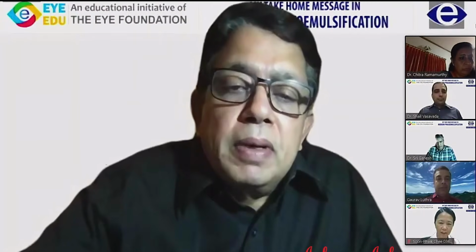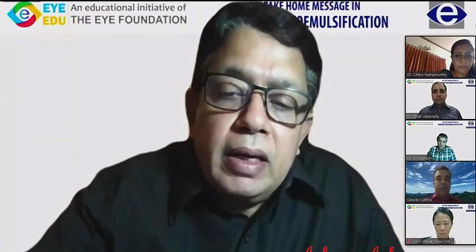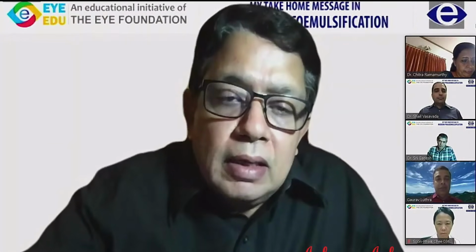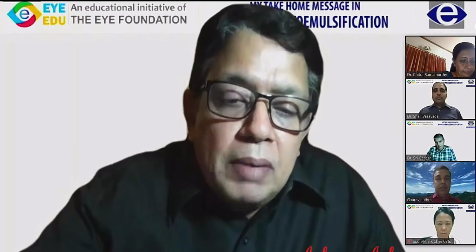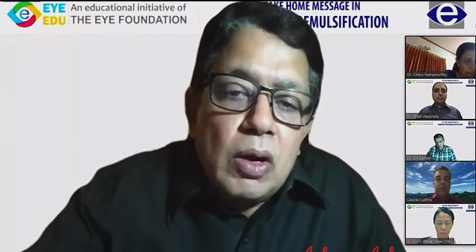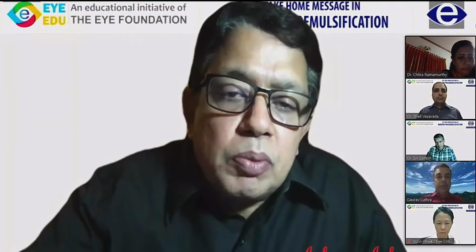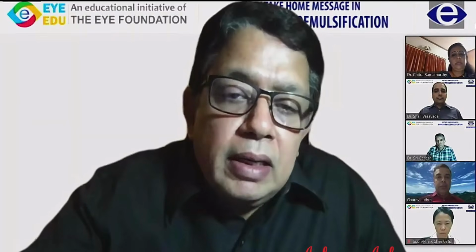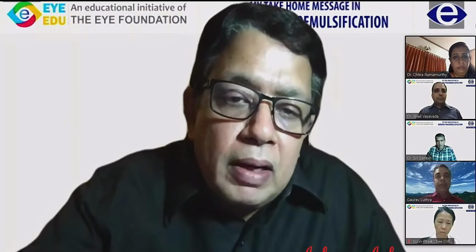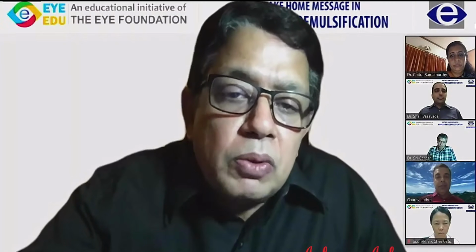Very important points made, and I think it's extremely important for us to ensure that it's not a hypotonic eye in which we are trying to make an entry. That's when you end up in problems. And secondly, as Gaurav emphasized, I think it all depends upon the stage at which you have to do an anterior vitrectomy. If all the nucleus is out and during capsular polishing you have a small rent, then if just vitreous pops out, maybe with the Triamcinolone staining, even an anterior route will be good enough. But for the kind of cases that Shail showed, where most of the nucleus is still there and we have an admixture of vitreous and nucleus, maybe going through the posterior route would be the right way.